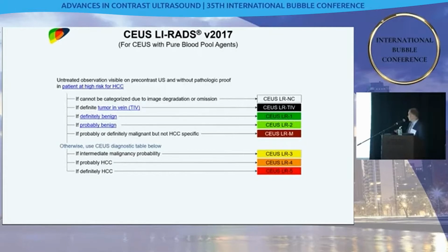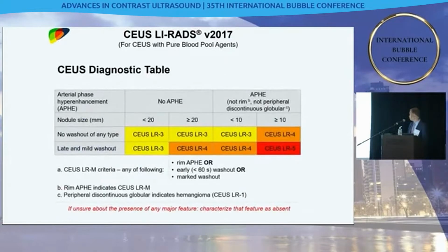A very interesting and very important category is LI-RADS M. Those are lesions that we feel are malignant. We just don't have enough diagnostic confidence to call them straight HCCs. And the reason we want this category, for lesions which we don't know what they are, is that we will biopsy LI-RADS M lesions. LI-RADS 5s should go straight to treatment, TACE, Y90, ablation or whatnot, but if we're not sure, we want to have this LI-RADS M category to filter those lesions that are either suspicious or poorly differentiated tumors that need some additional tissue sampling.